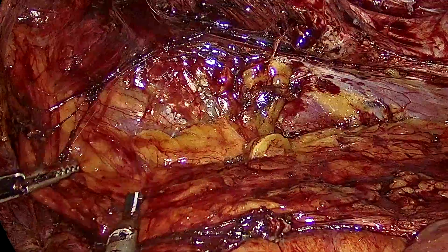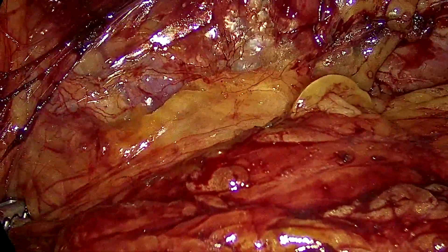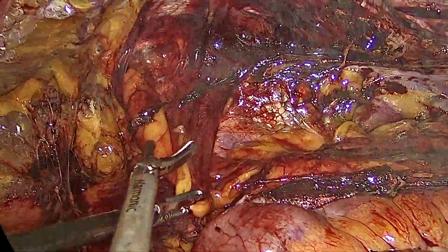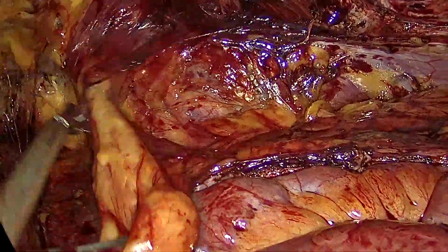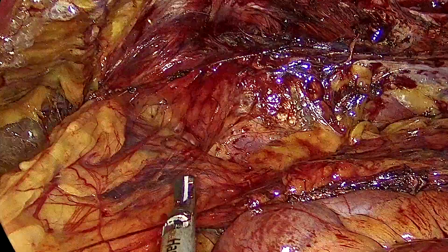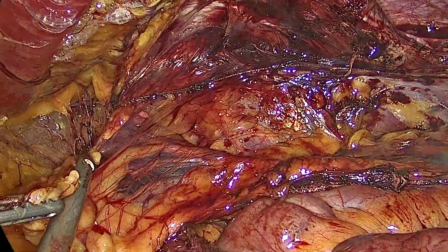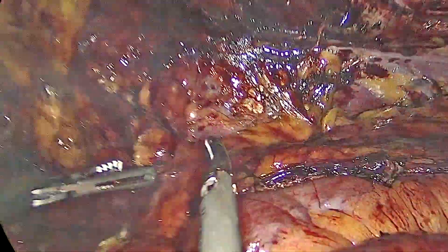The critical view steps are followed and a canal lipoma is reduced. The left hernia repair is then performed.